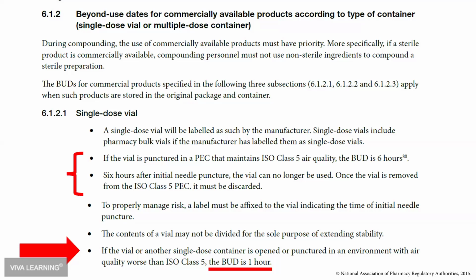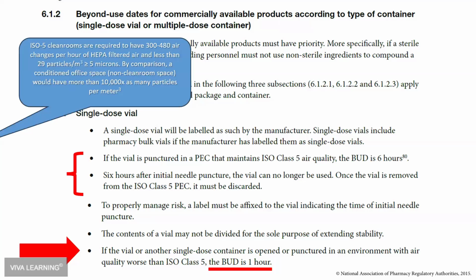And I've heard some other authors and speakers talk about how we should refrigerate this vial to prolong its shelf life. But we just don't have any good data about how long that will be. And so that's my biggest concern with chairside hand buffering: that vial of bicarb is really not going to last very long.